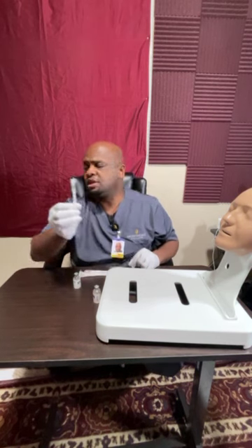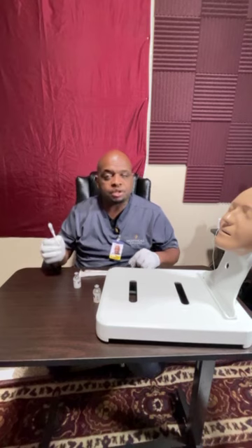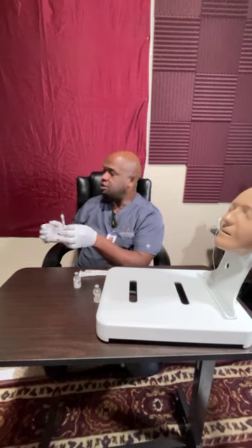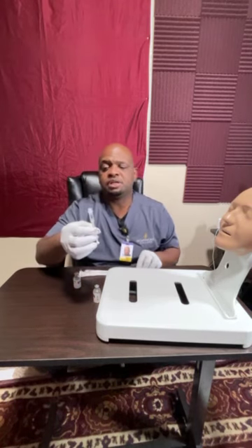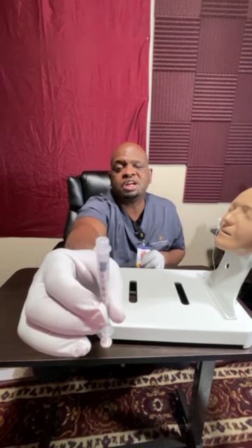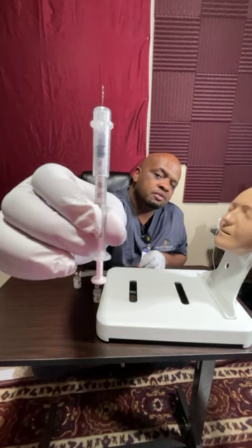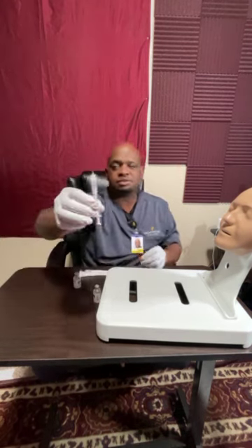And I'm going to let the nurse verify. The nurse double checks. She's comparing it to the MAR. She checked. Everything looks good. Okay, good. Let me put that up to the camera. There's a total of 12 units. There's no air bubble. Oops, sorry. 12 units there. There's no air bubble.